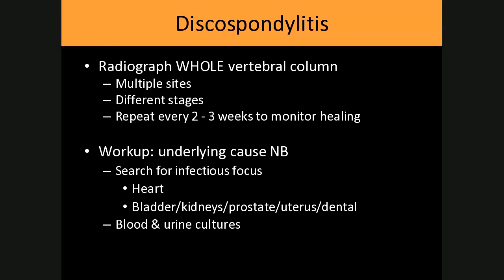And then a sample can be attempted directly from the intervertebral disc if it is accessible via ultrasound or fluoroscopic guidance. And the clinical signs, which most commonly is pain, can precede radiological lesions by up to 3 to 4 weeks. And clinical recovery may occur despite worsening of the radiological signs. And this is very typical for most radiological studies.